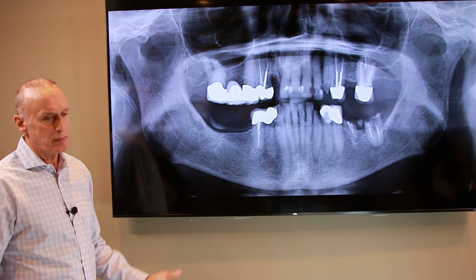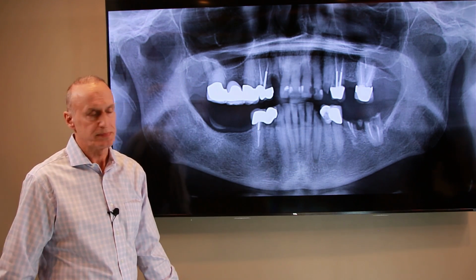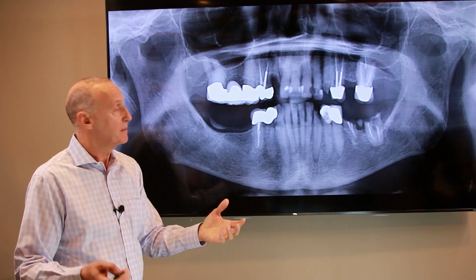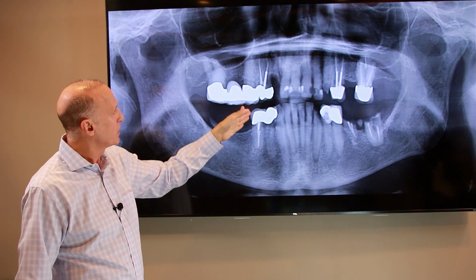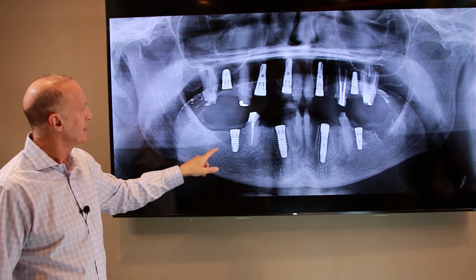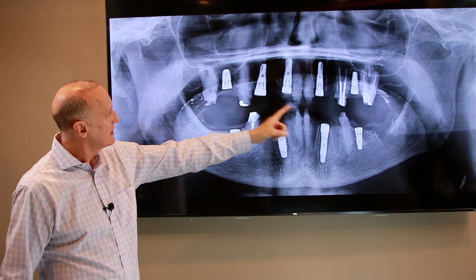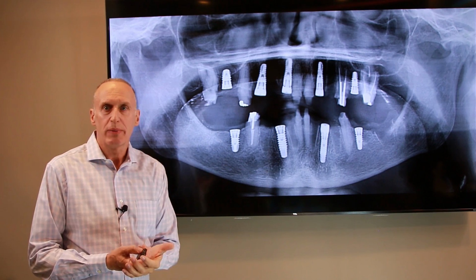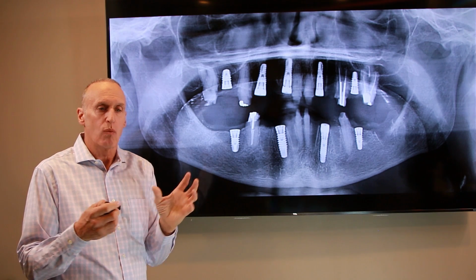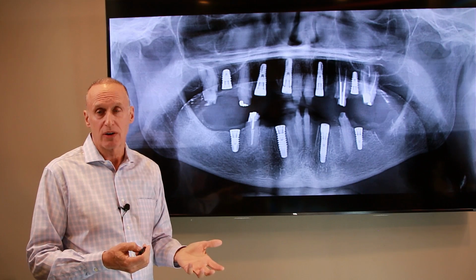So what I do now is I talk to the patients. I'm going to take strategic teeth out. Obviously, all the really bad teeth are coming out first. But any tooth that could serve as a short-term abutment for 2.5 months, we're going to leave in. So I'll take all the bad teeth out, I'll separate the bridges, and I'll put my first pass of implants in. So I got 5 upper implants in, 4 lower implants in, but none of the implants were strong enough to hold the temporary. But I haven't burned the bridge. I left 6 teeth in the upper, 4 teeth in the lower, so now the patient can go home with a beautiful fixed temporary, comfortable, aesthetic, and then while the implants are healing at that microscopic bone level, they're not suffering in any way. In fact, many of them leave here much better off than they came in.